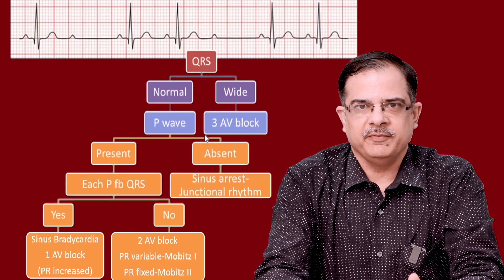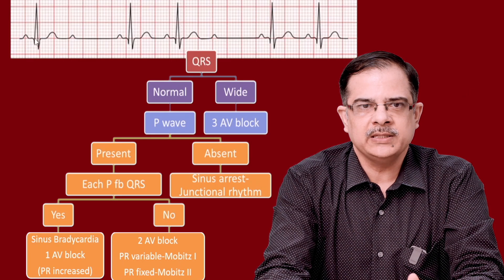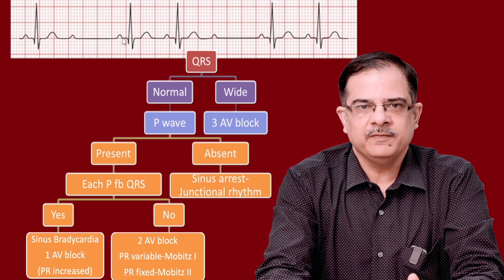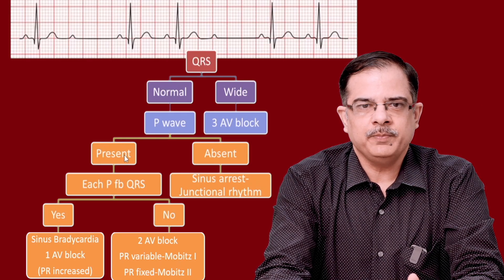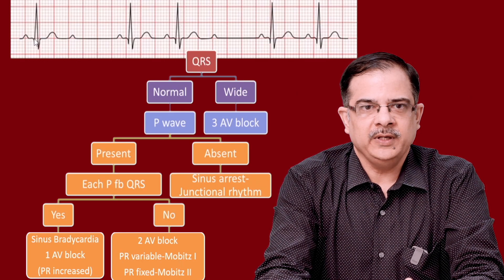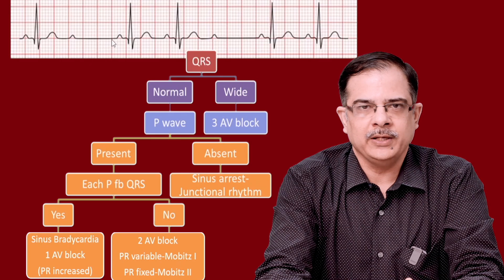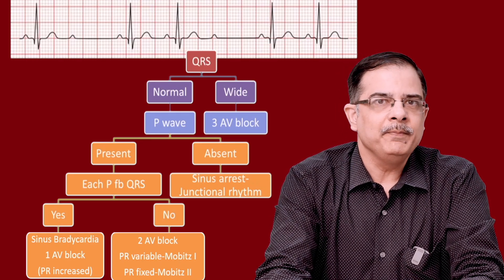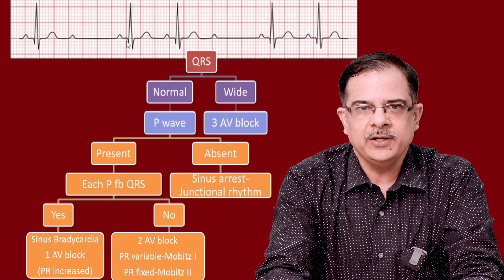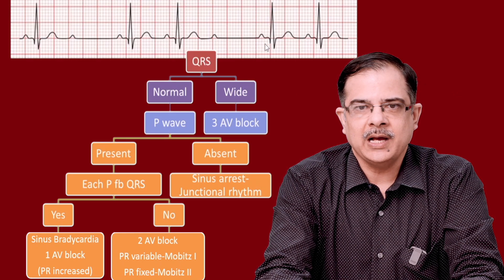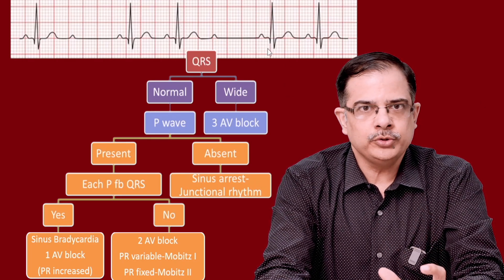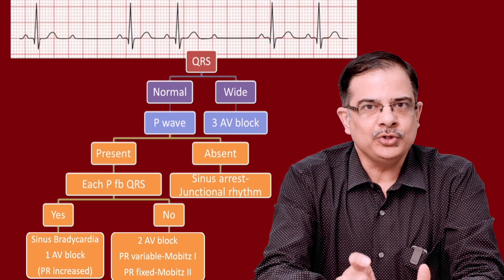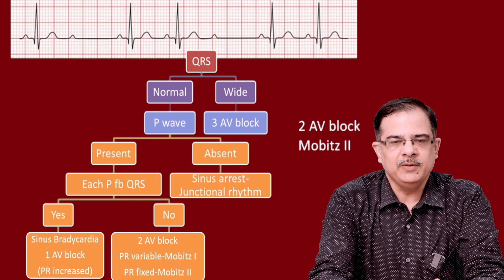Next ECG, same flowchart: QRS complex is normal width, less than 3 mm. P waves are present. Assessing each P followed by QRS: the first P wave is followed by QRS, but the second P is not — second degree AV block. Looking at PR interval: it is fairly constant throughout, approximately 4 to 5 mm on each beat. In Mobitz type 2, PR interval remains the same throughout the cardiac cycle — it can be normal or prolonged. Therefore this is second degree Mobitz type 2.